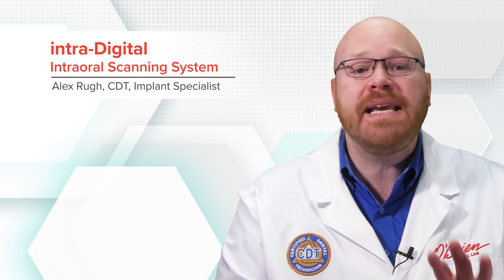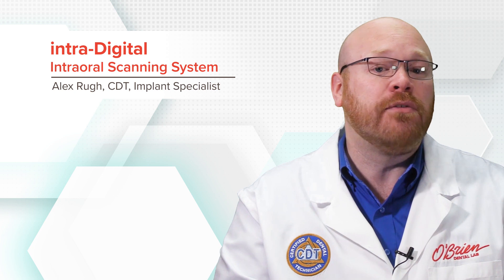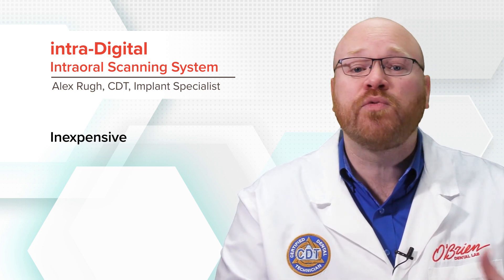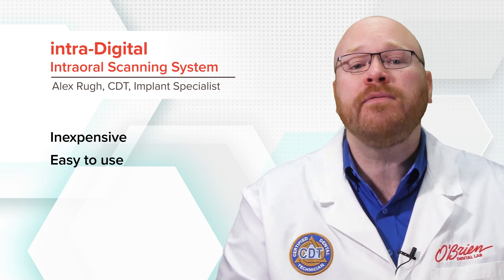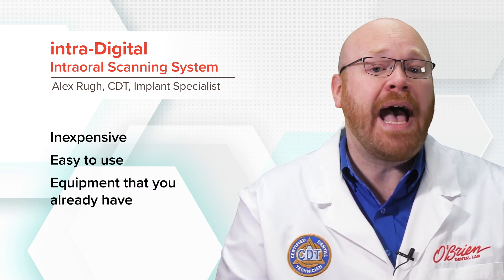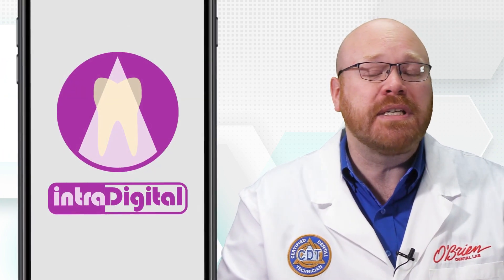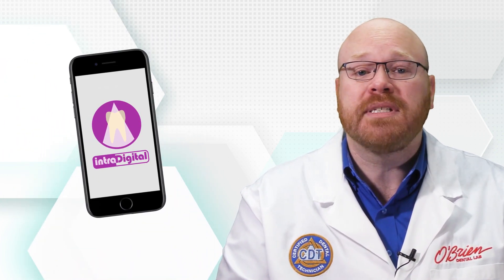Hey everyone, Alex from O'Brien here. In the last several years, digital impression systems have continued to gain in popularity, and today I want to show you an innovative new system that takes intraoral scanning to a whole new level. It's called Intradigital, and it's actually an app that turns your existing smartphone into an intraoral scanner.